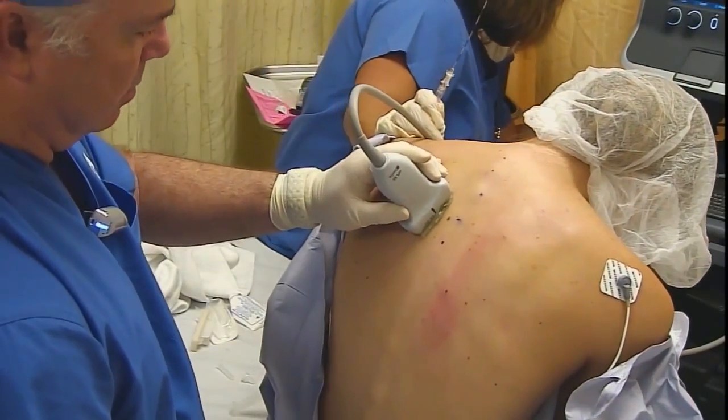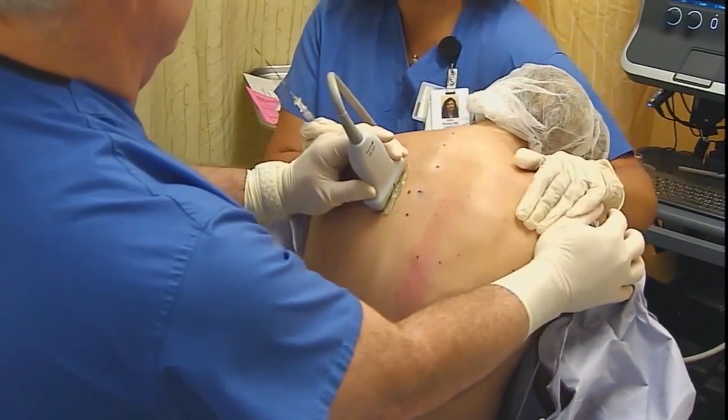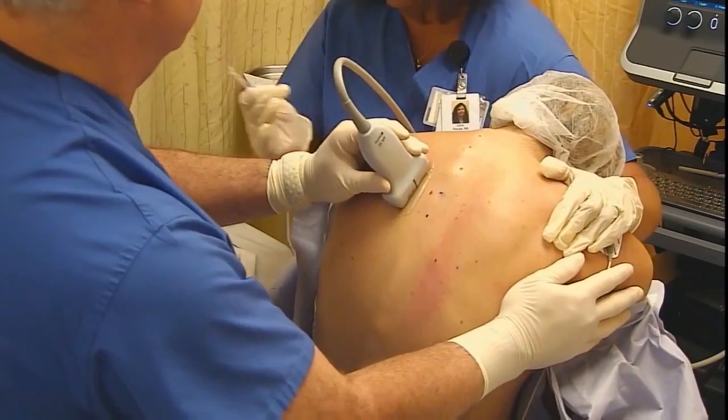I'm doing thoracic paravertebral blocks here. You can see we've marked off C7 through T4, and we're going to go with the T3-4 level to do this first paravertebral block.